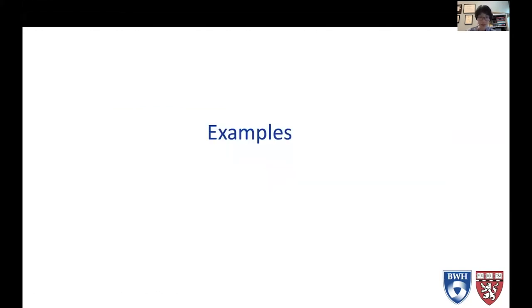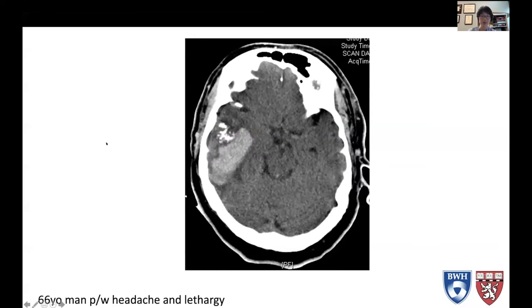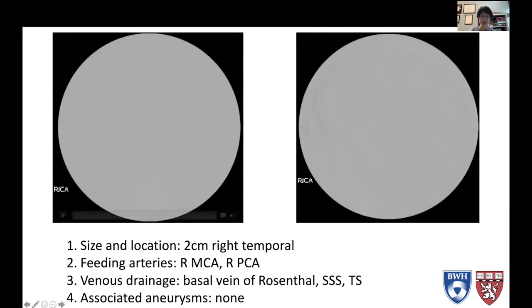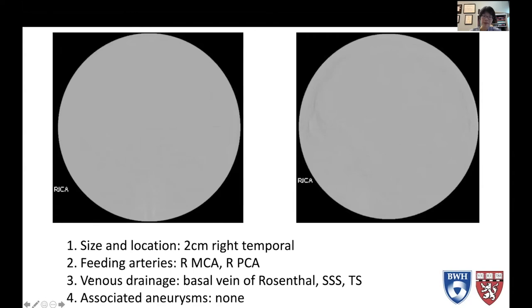Let's go through some examples of AVMs and how we describe them. This is a 66-year-old man who presented with headache and lethargy. You can see there's a hemorrhage in the temporal lobe. You can also see some calcifications here — AVMs are sometimes associated with calcifications. So how do we describe this AVM? First, size and location: this is a two centimeter right temporal AVM. To describe the vascular structure, you would need something like an angiogram.